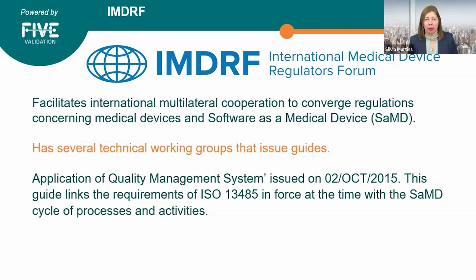In 19.8.3, it's highlighted that having appropriately qualified automation tools and support infrastructure is crucial for effectively managing configuration and ensuring traceability of other lifecycle activities. This underscores the advantage that infrastructure qualification can provide us when considering patient safety and clinical environment factors, as emphasized in various SaMD lifecycle processes and activities. It's essential to account for people, technology, infrastructure, and the potential new hazards arising from implementation and usage. The qualification process for IT infrastructure can effectively address these considerations.